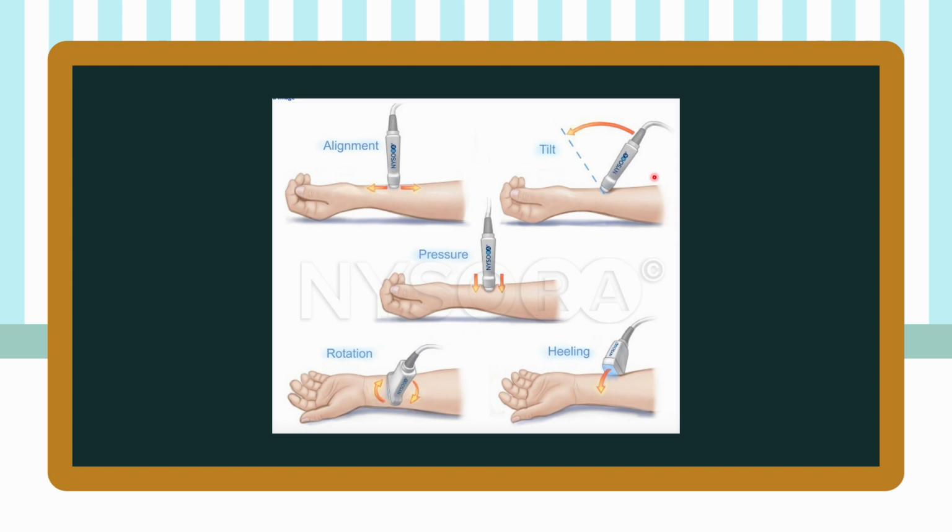When the needle is not visible, this is called anisotropy. Anisotropy occurs when it is impossible to visualize the desired structure of interest due to the loss of the sound waves resulting from decreased reflection back to the transducer. To get an optimal image, the needle and the ultrasound probe should be aligned at a 90-degree angle. This perpendicular angle maximizes the reflection of ultrasound beams from the needle.